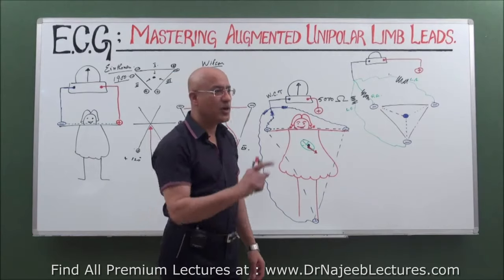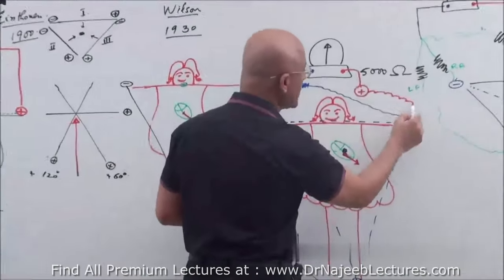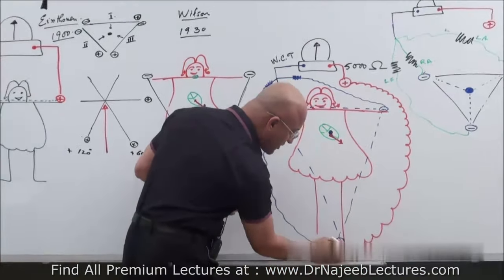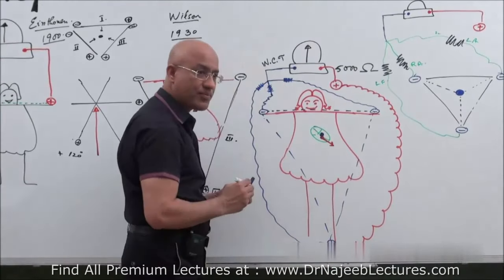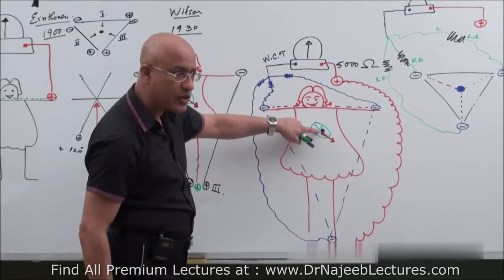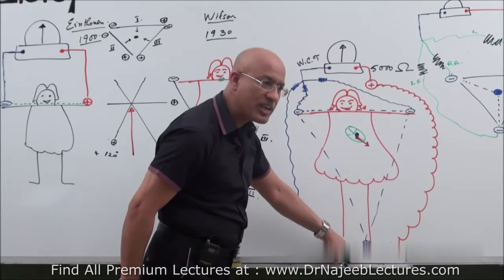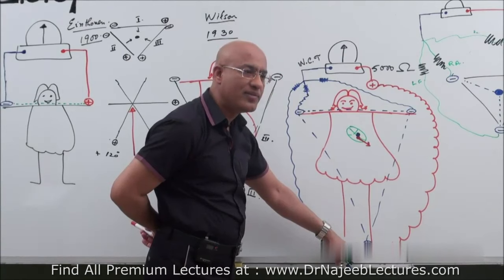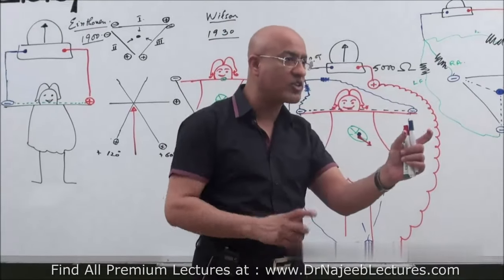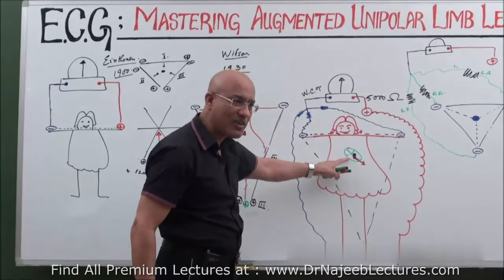You understand it? Now look at it. In this case, what was this wire? Negative electrode, positive electrode? Positive electrode. Then he came to the real naughty thing. He put the positive on this foot. Now the negative terminal is converted into an indifferent terminal, and the indifferent terminal is here, and the positive terminal is here. Now it has been converted into a bipolar lead or unipolar lead? Unipolar lead, because our previous definition was that when the positive electrode is exploring the potential referenced against the virtual indifferent electrode, this is a unipolar lead.